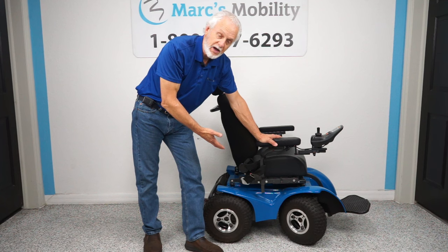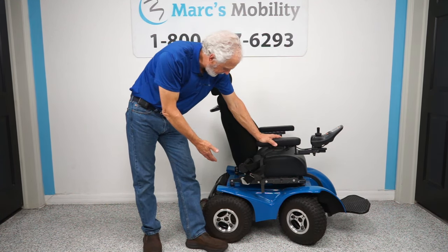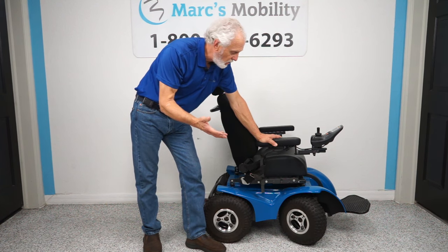This one has new tires. This chair was used — a gentleman had this chair and then got a brand new one. We don't know how many miles are on it; it doesn't show on the joystick. It was used, but he did put new tires on it and it runs like new.